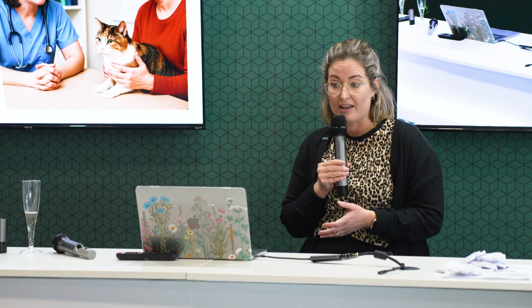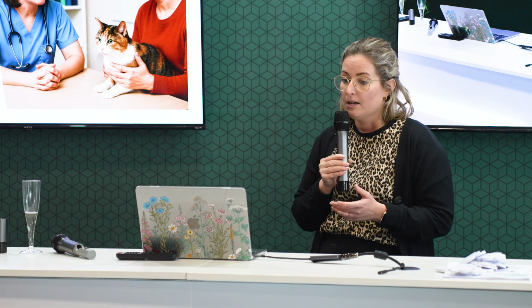In terms of things we want to just talk about with our client, as we said, we're going to want to counsel them as to the lifespan of those sensors. We're also going to want to obviously explain the benefits of having this on. So that means for their patient less needle sticks, perhaps less physical trips into the veterinary clinic. There will be times where the owner still might need to do a blood spot glucose or maybe a urine dipstick, but those things, I guess, are going to be less frequent if we have one of these on. But just laying out those expectations for what we hope to achieve with that sensor in situ and how we hope it's going to benefit them and their pets.